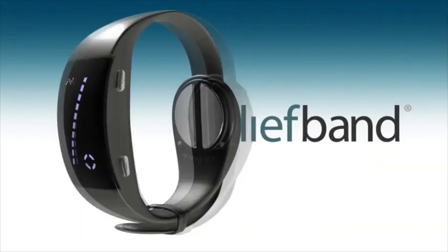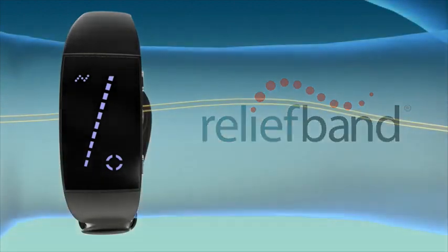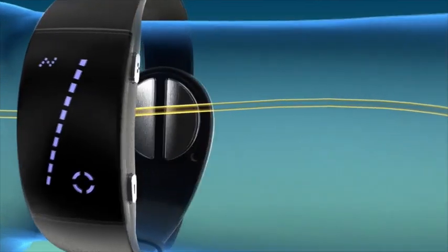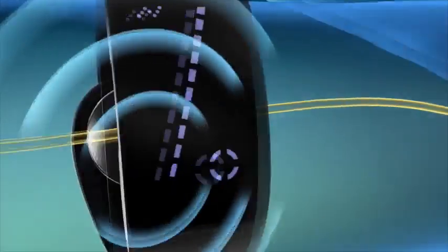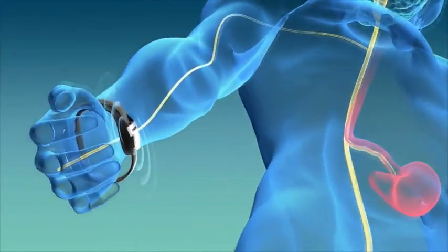Relief Band is wearable technology that puts you in control of nausea and vomiting without drugs. Relief Band works by generating a pattern of highly specific pulses that modulate the median nerve on the underside of the wrist using a process called neuromodulation.